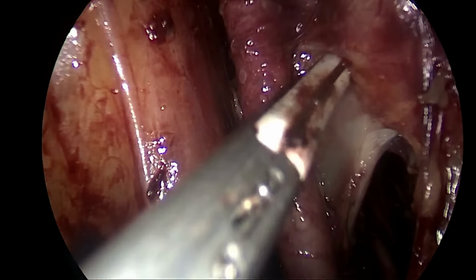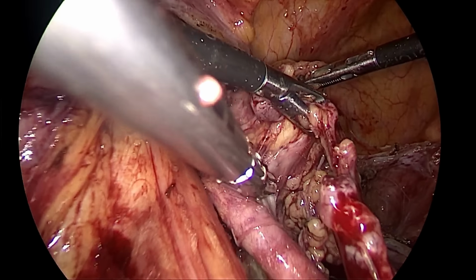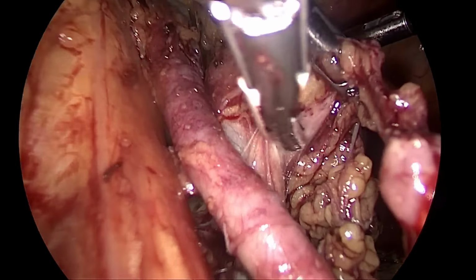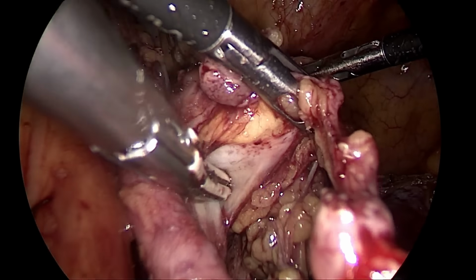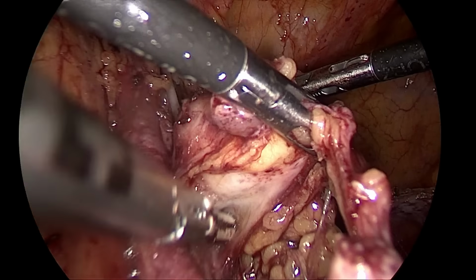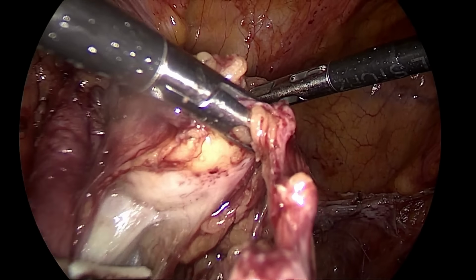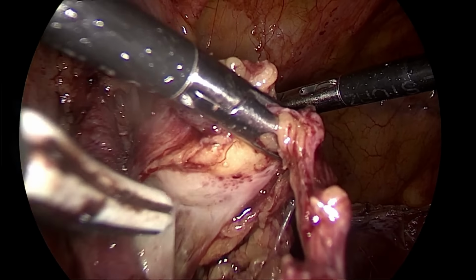Now we can clearly identify the node is densely attached with the external iliac vein. So now I am trying if we can separate the node from the external iliac vein, and luckily in this case the node got separated from the external iliac vein. But sometimes if it is densely stuck, we may have to partially take some wall of the external iliac vein and we have to then repair it.